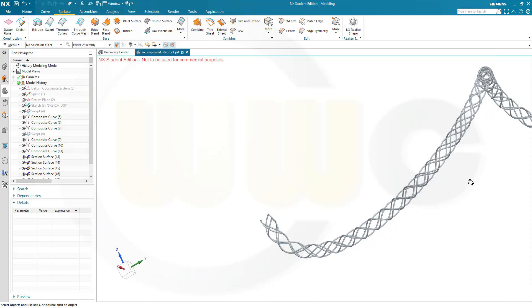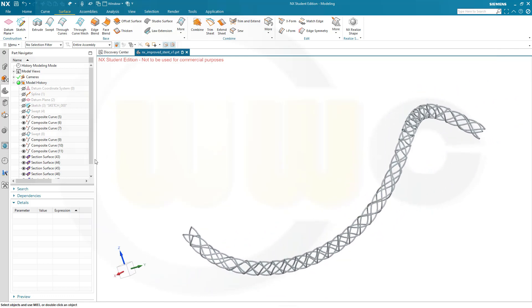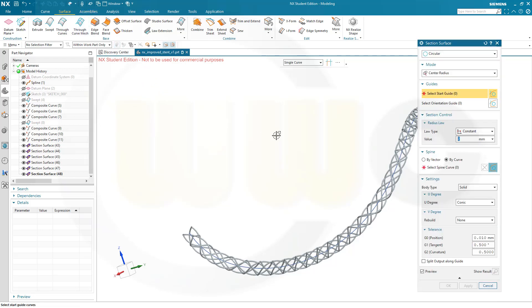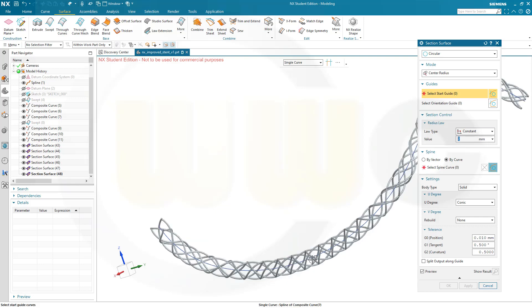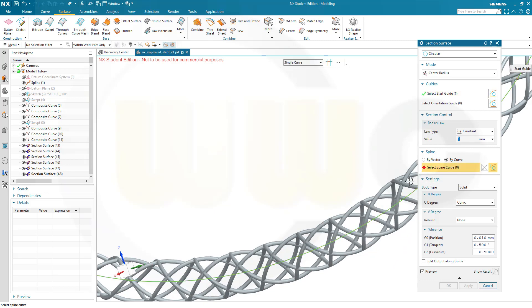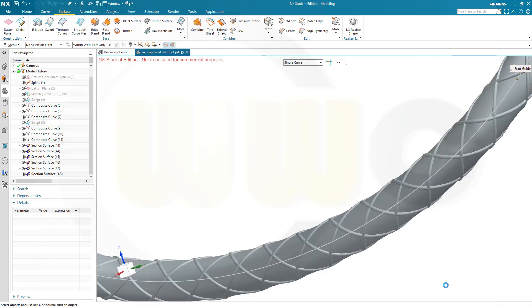Now I want to use another section surface. Let's use our first 3D spline here and do another section surface. Now I want to go for 41 divided by 2. So let's use that curve again, and this should be 41 divided by 2, and confirm.